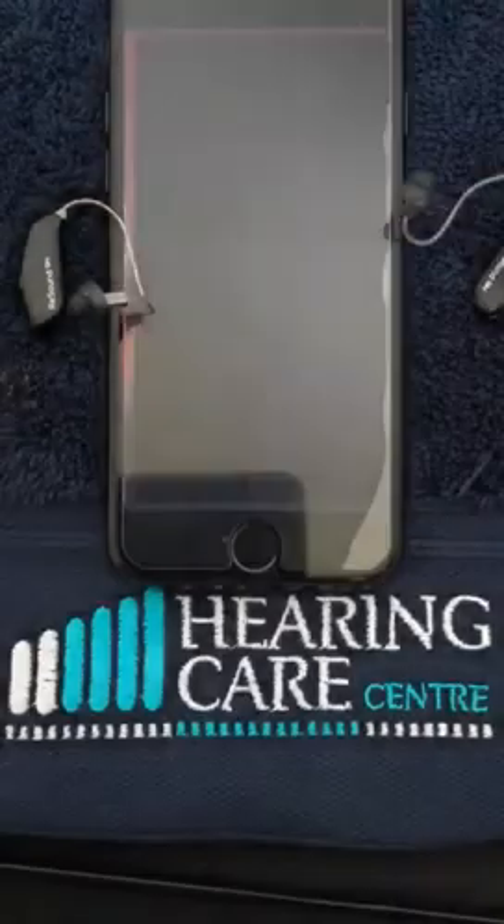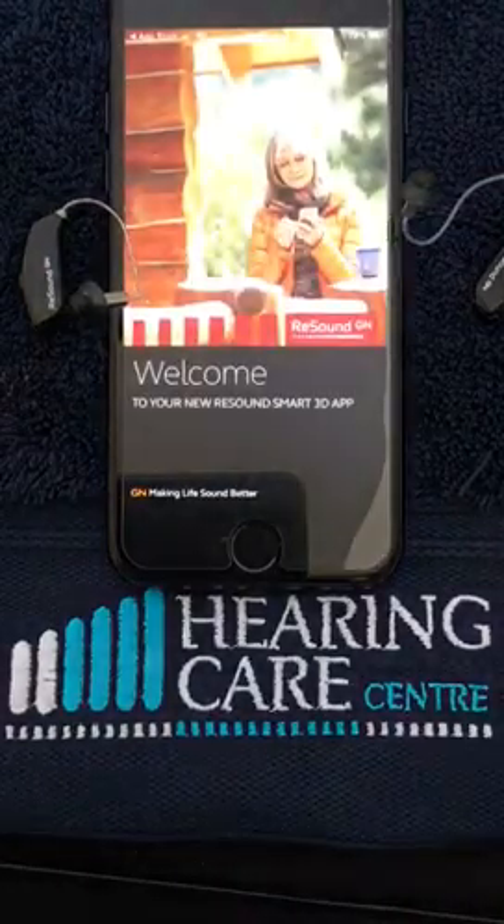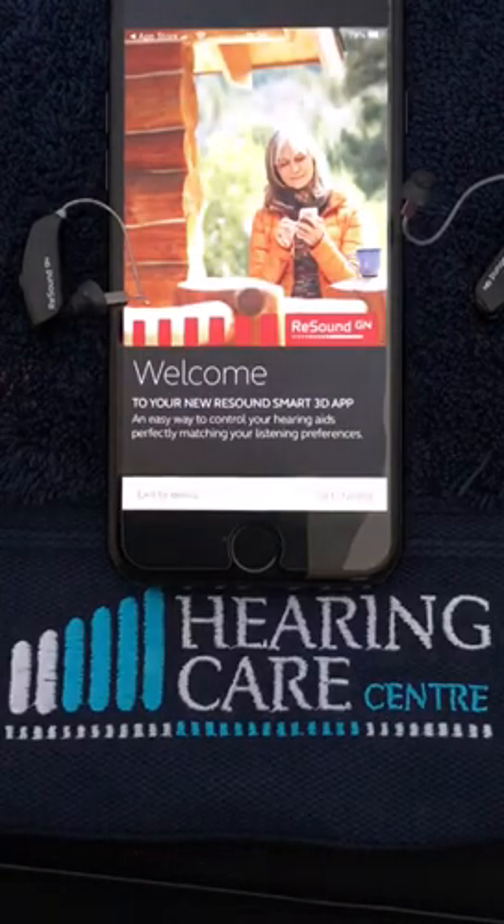So we hit open. It's important to note we have about a 12-second pairing window, so we don't have long. If you run out of time, just do it again.